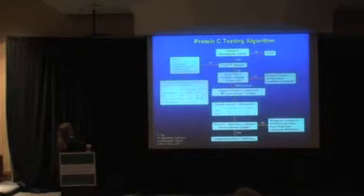If not, then you want to repeat your protein C activity, maybe measure protein C antigen to try to distinguish type 1 from type 2 protein C deficiency. Type 1 is a true deficiency in both the antigen and the activity. Everything's low. It's probably a gene deletion. Type 2, if there's a point mutation, the activity may be low, but the antigen, the amount of protein there, may be normal. You want to confirm the deficiency on a new sample before you call somebody congenital protein C deficiency.